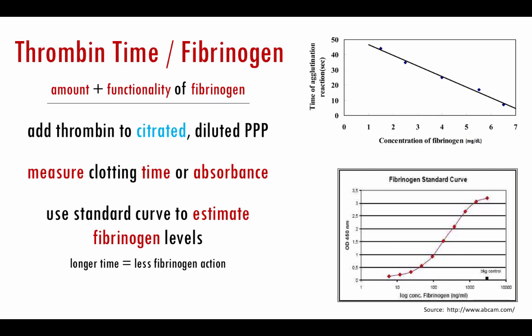So it's very similar to what we have seen before, but it's really taking that little final piece of the pathway and examining it and saying, all right, is the fibrinogen there? How much do we have? And does it work? Those are two really important questions to answer.